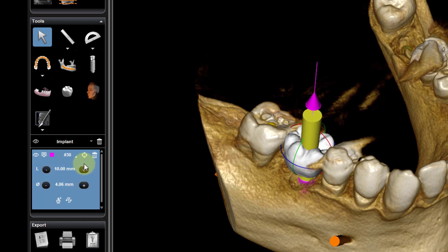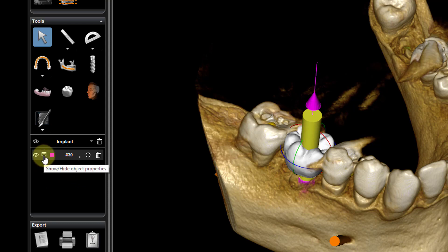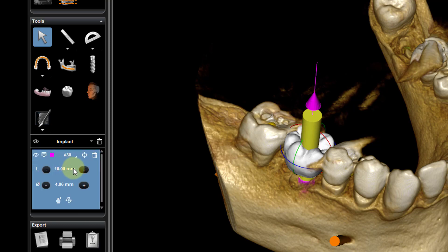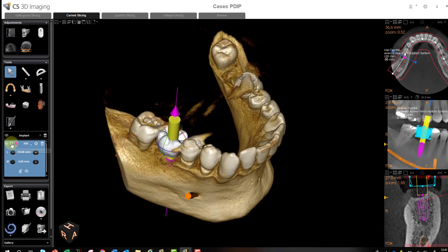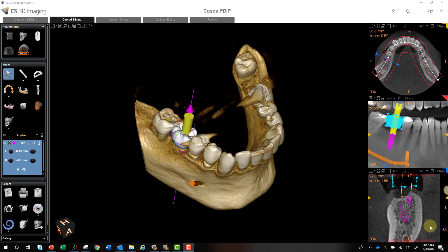Opening the window reveals a variety of options. The Show/Hide Object Properties button is there whether or not the blue bar is open. Selecting it hides the object properties so you can more easily manipulate your implants.